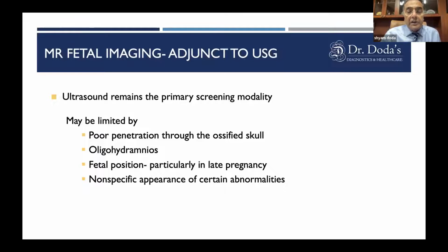It's a very, very large area. Sometimes you can have problems while doing ultrasound, especially when you have, let's say, a fully developed ossified skull, and it is stuck lower down in the pelvis, and it is difficult to negotiate through and look for the kind of detail of anatomy which you want.